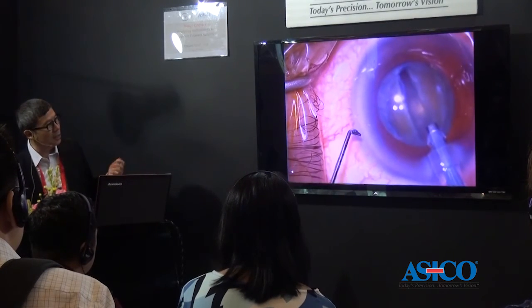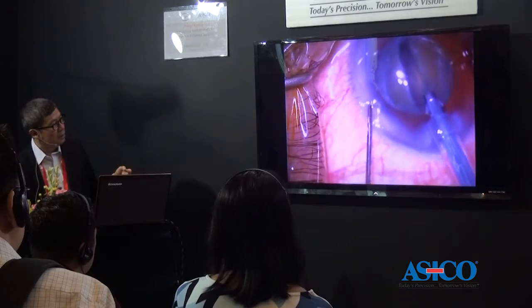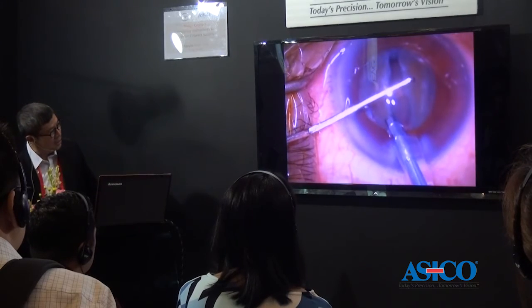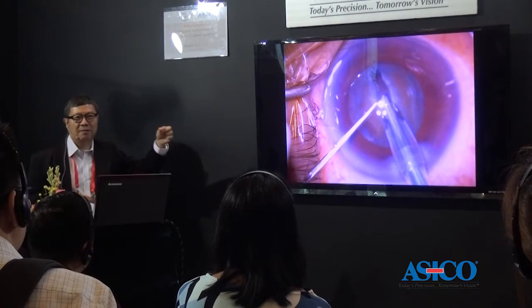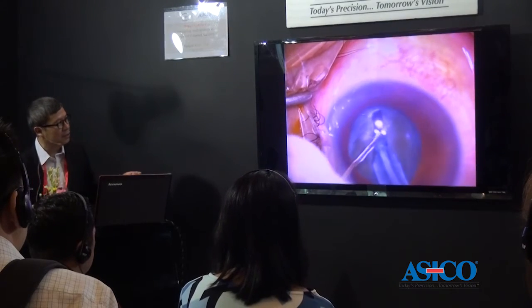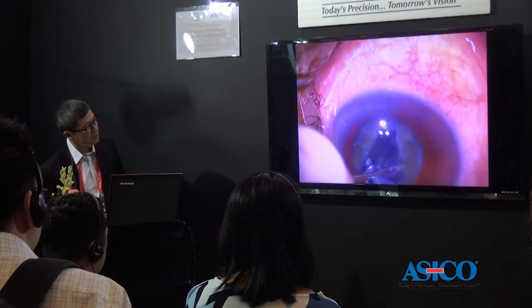And you can see that through that same 0.5 or 0.6 side port incision, I can now put this flat-topped splitter, and I like to use this instrument for almost all. You can see the flat top there very, very clearly. So it goes in easily, and at 0.5, I guarantee you there's minimal leakage, whichever part of the shaft of my instrument is in the eye. All right? And then you can just carry on with that chopping very, very effectively and get on with the rest of the surgery.